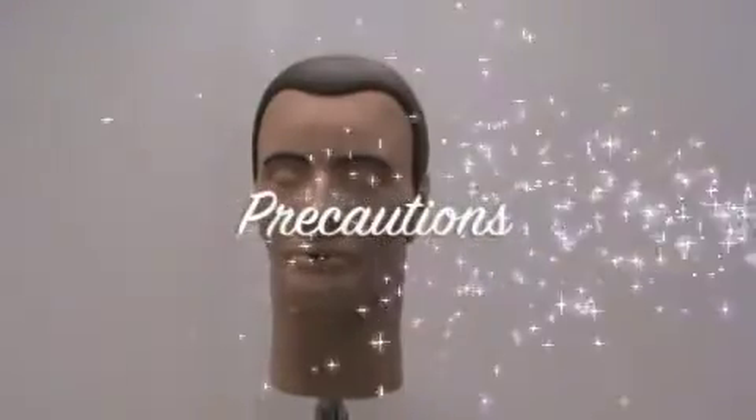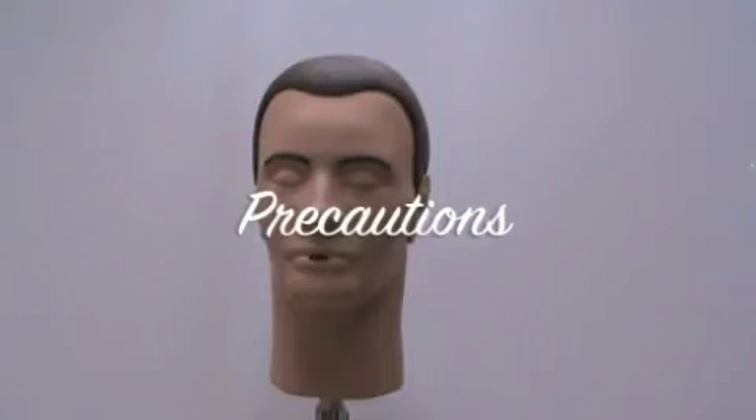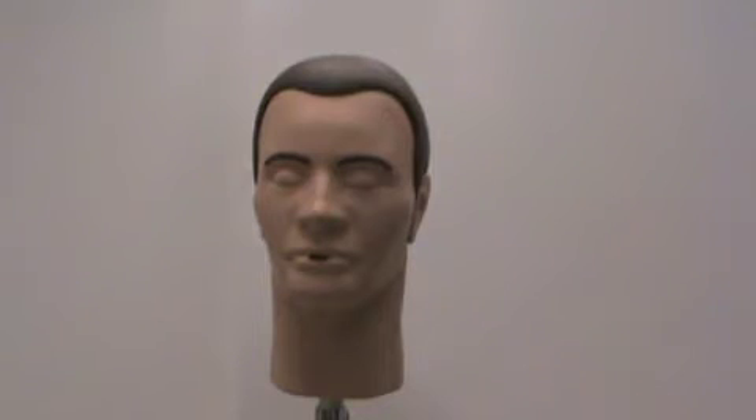A few precautions about your Pan-Dexter: do not store in direct sunlight. Store Pan-Dexter in an upright position. Do not adjust Pan-Dexter's stand without fully supporting his head. Use caution when moving Dexter to avoid tipping.